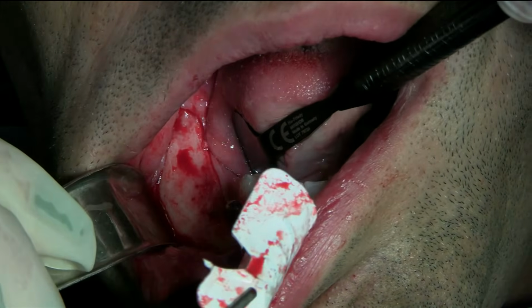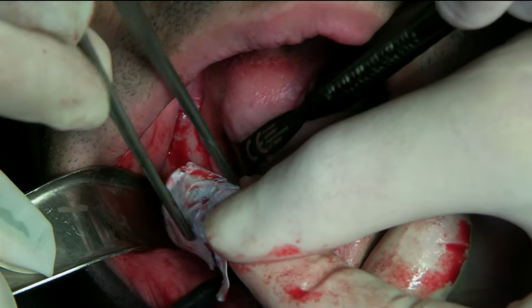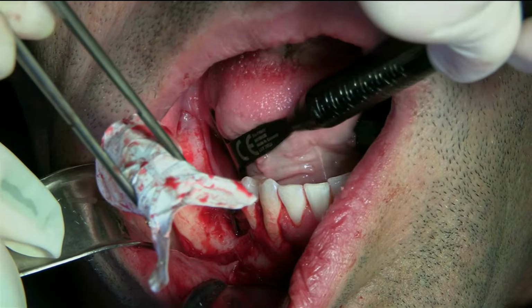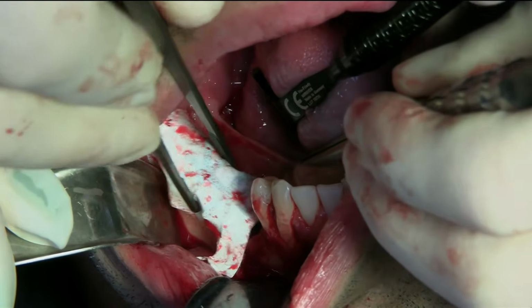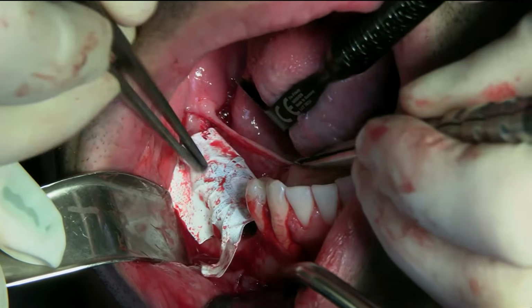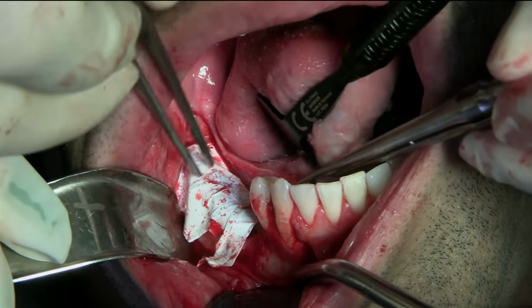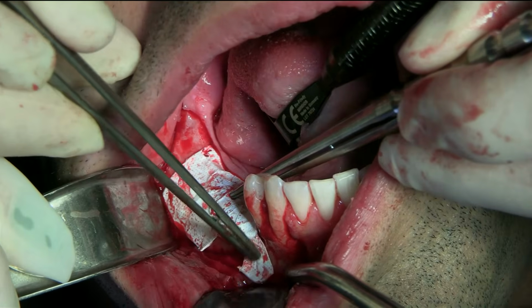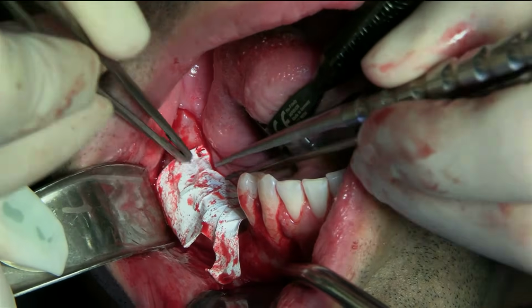Okay. So I just cut a little piece out of the PTFE to allow the. No, that's not. Okay. Here we go. We're going to retract again the. No, it's not going to work. Okay. So I kept the membrane open where the mental foramen is.